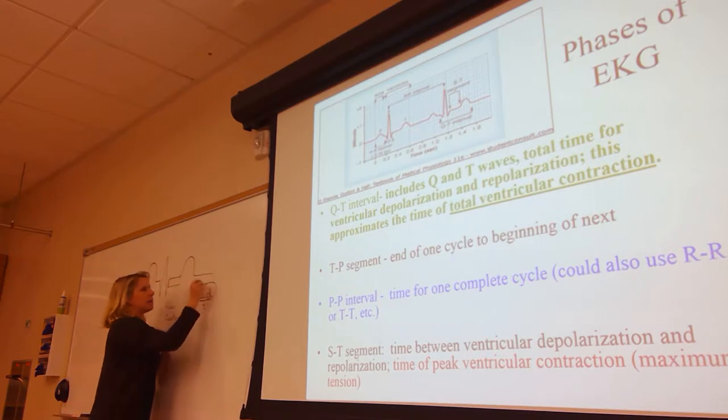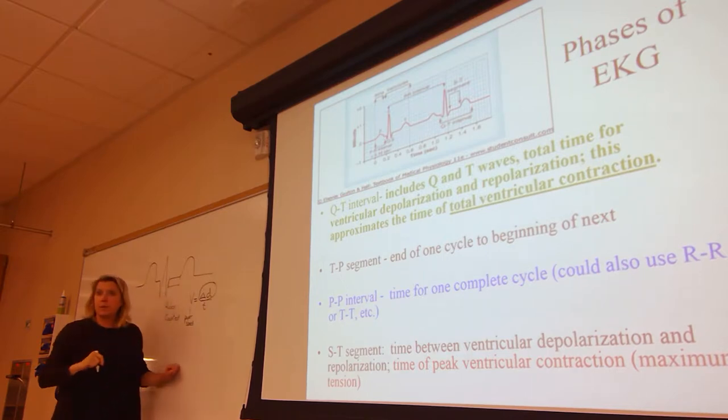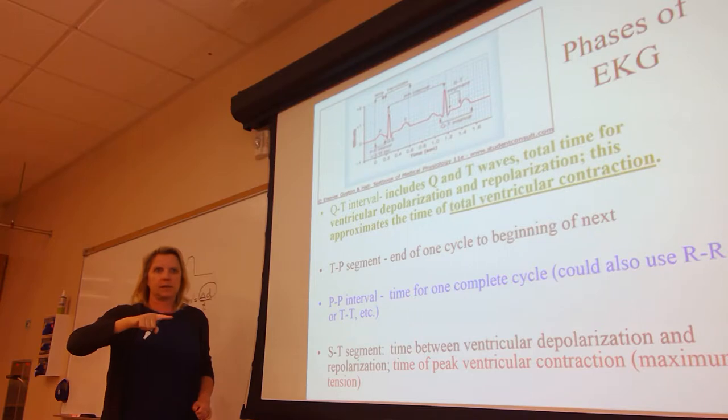Distance. That's what you measured with your ruler or counted the dots. It's in millimeters. Do you remember what millimeters are, using those rulers? Make sure you review what a millimeter is.